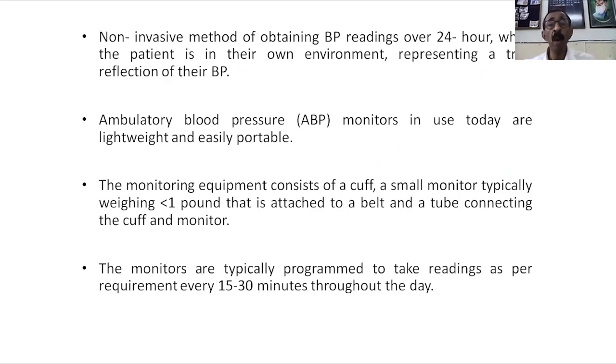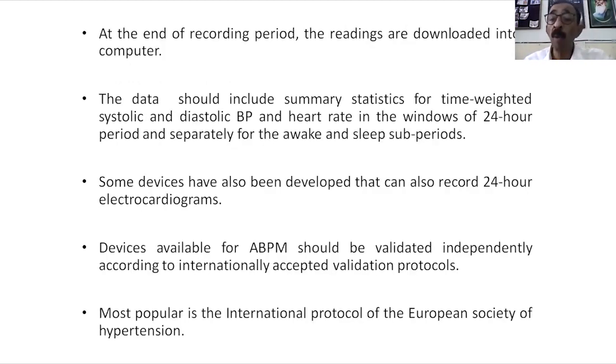It is programmed so that the readings are recorded every 15 to 30 minutes throughout the next 24 hours. And then after this 24-hour period, the entire data is put into the analysis by a computer. But what is more important is validation of these readings.